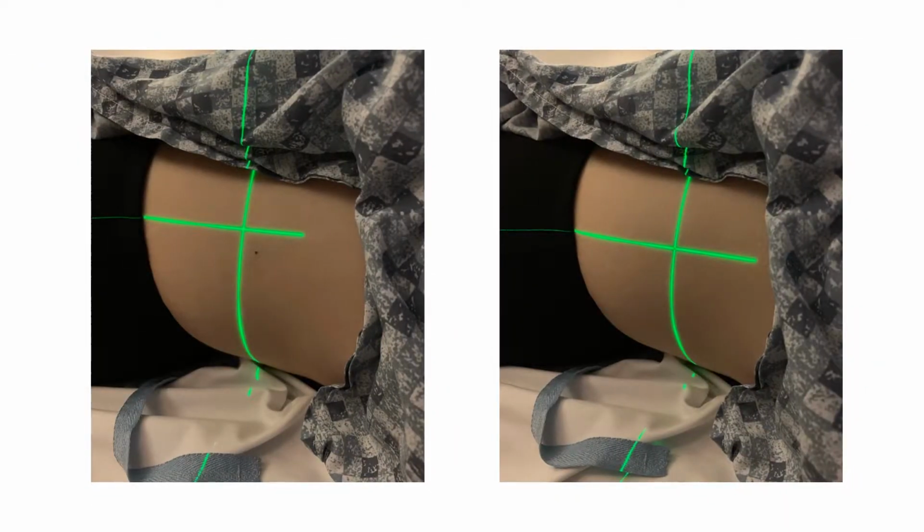By aligning all the lasers with your unique marks, we know that you are in the same position as you were during the simulation. Reproducing this position is important because this is what your treatment plan is based on.